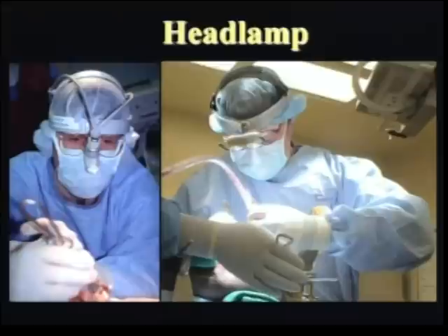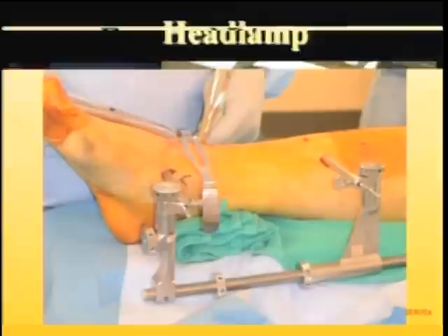I always use a headlamp. I can't imagine not doing so. You can see me here 10 years later with the same rims on my glasses as Dr. Benerska. I always use a femoral distractor. I can't imagine fixing a pilon fracture without it.